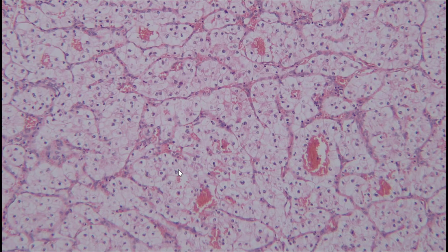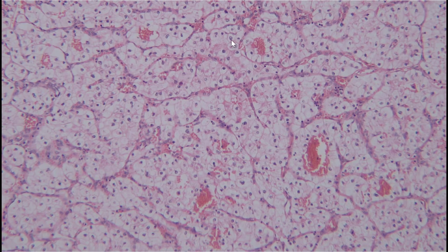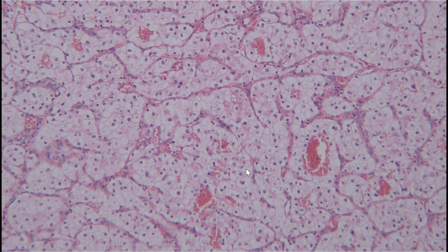On the 10x objective, you can make out a little more pleomorphism — some cells are slightly larger than others — and there is some binucleation. Notably, you can start to make out nucleoli from the 10x objective, which is going to be important diagnostically.